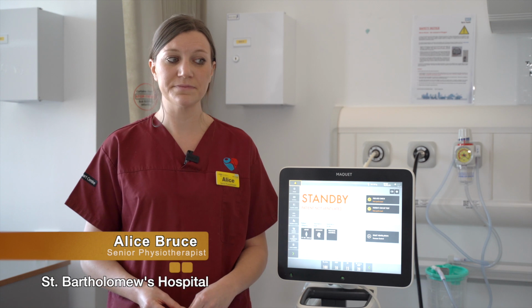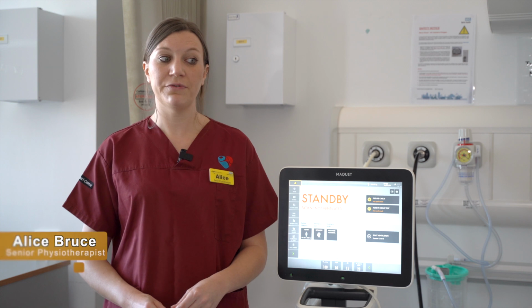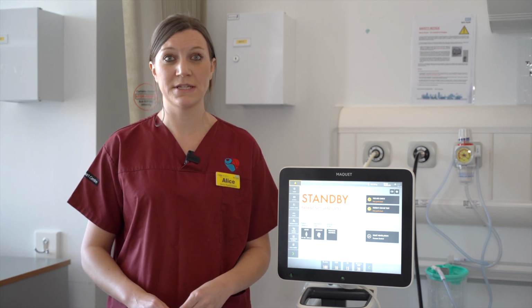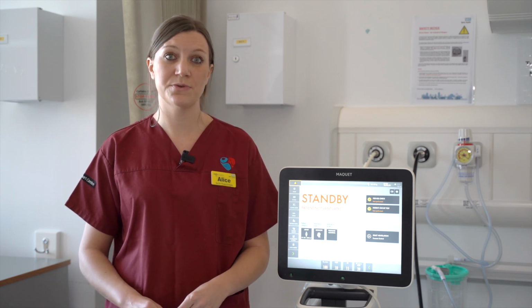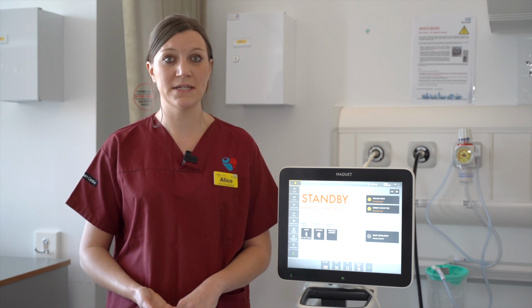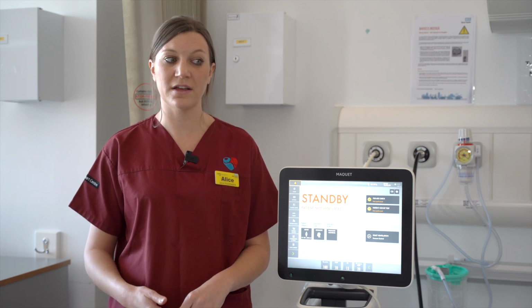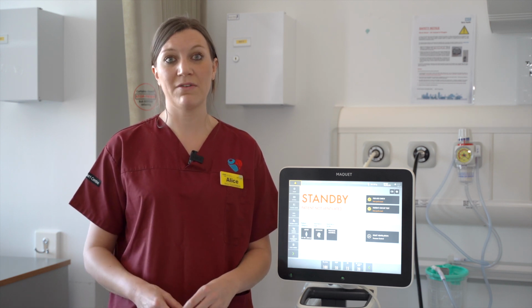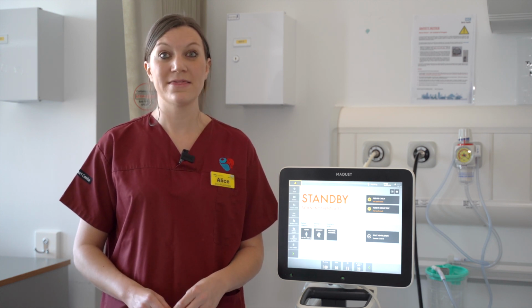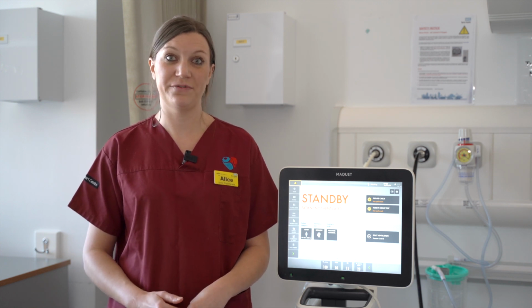carbon dioxide. On approaching the patient, it's important to feel the chest wall, feel for the movement, and see if you've got equal expansion left and right. It's also really important to auscultate these patients, having a listen for breath sounds, whether they are present or absent or harsh, and also whether there's any additional sounds, any secretion load that can be heard. Remember to check for all patients the length of the endotracheal tube at the lips. That will also be documented on the bedside chart and is checked every shift.